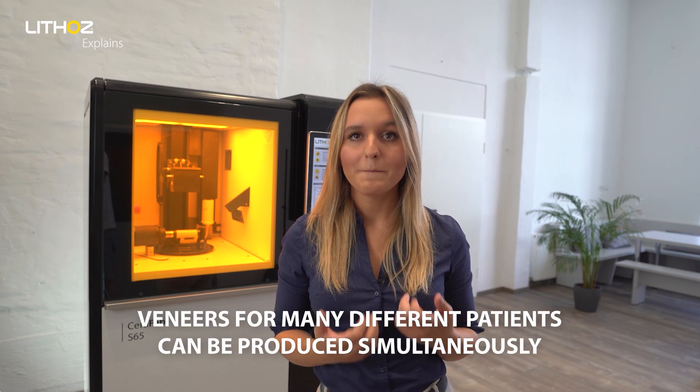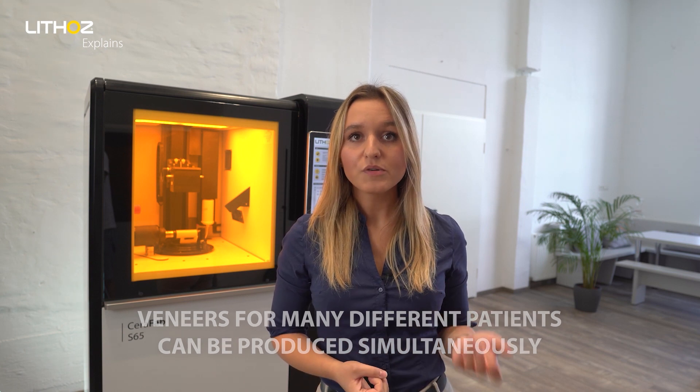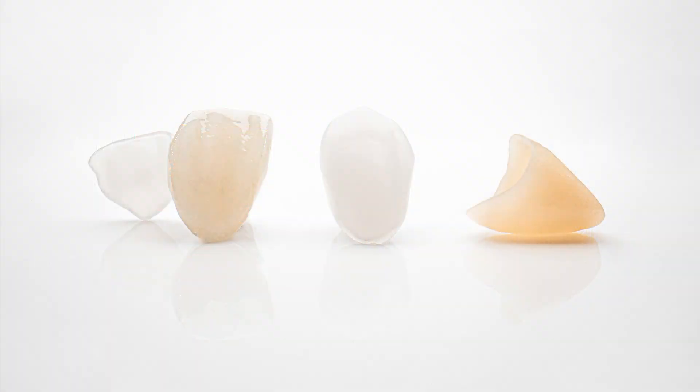Veneers for many different patients can be produced simultaneously, boosting productivity, while the wide range of materials available — such as alumina, zirconia, lithium disilicate and more — offers unlimited application possibilities.